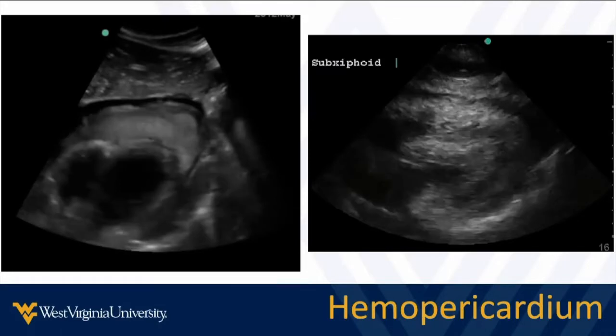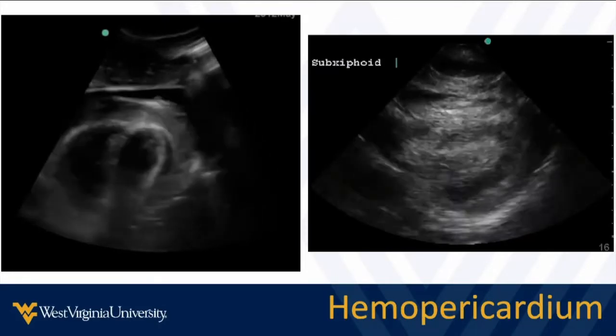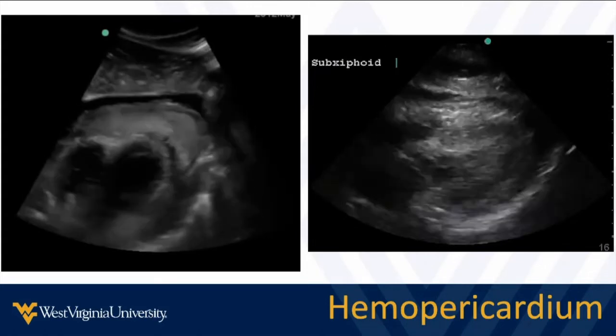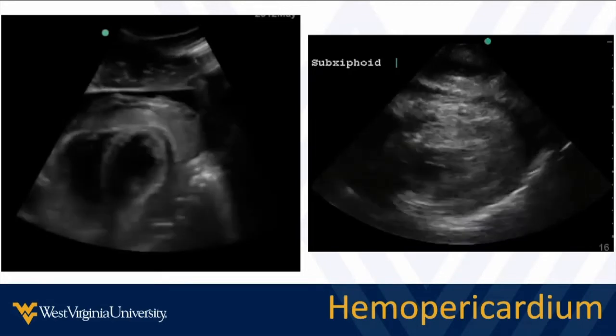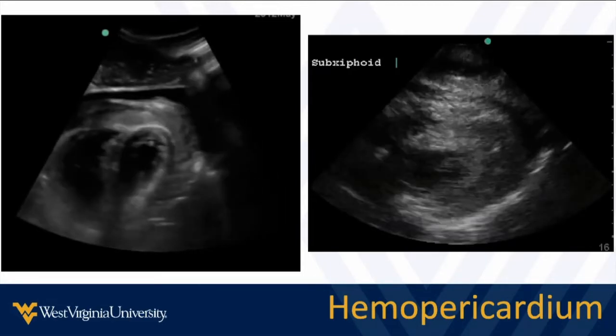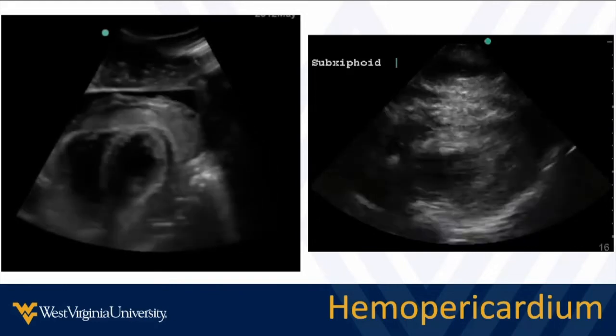And this happens. I've seen trauma patients who are in the emergency department within 15 minutes, and you find clot in their abdomen or their chest. And you see other patients where the blood looks black for hours. I can't tell you that it follows the linear clotting trajectory that we were all taught in medical school. I can just tell you that sometimes blood looks gray.